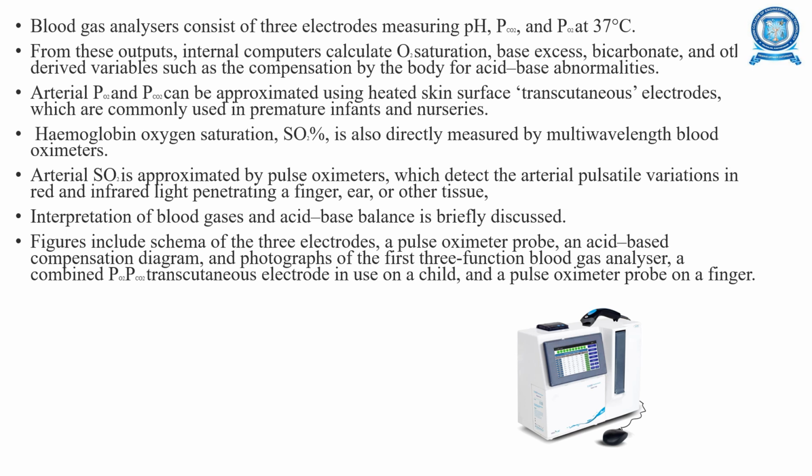In the first figure, the blood gas analyzer: a combined PO2 and PCO2 transcutaneous electrode in use on a child, and a pulse oximeter probe on the finger. So this is the diagram of the blood gas analyzer.